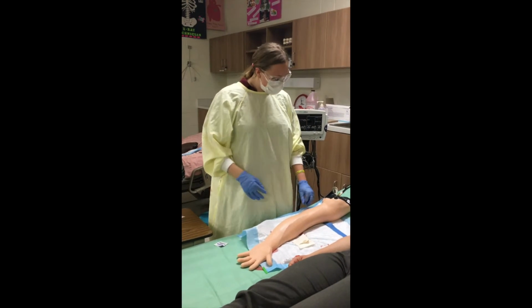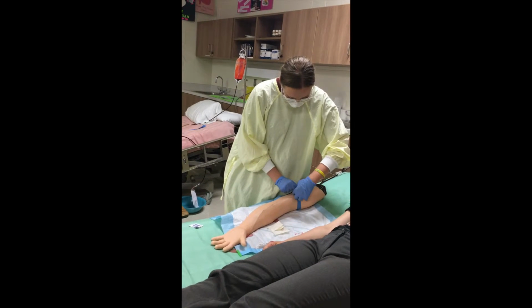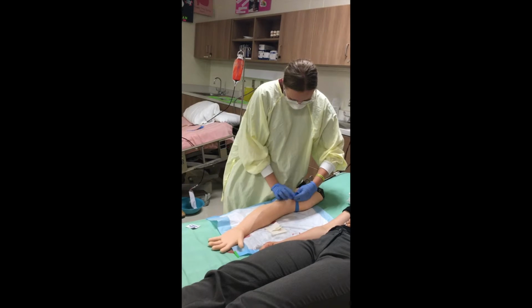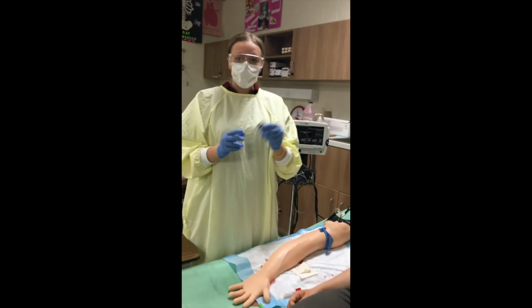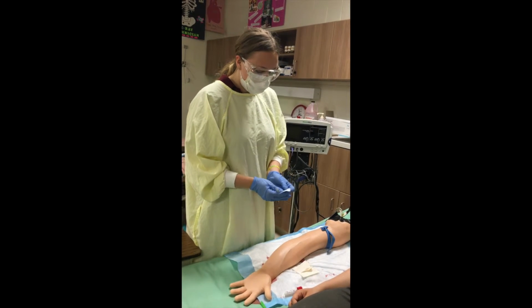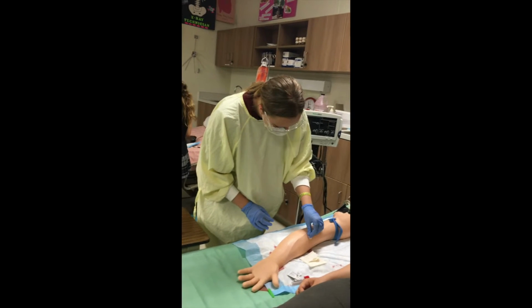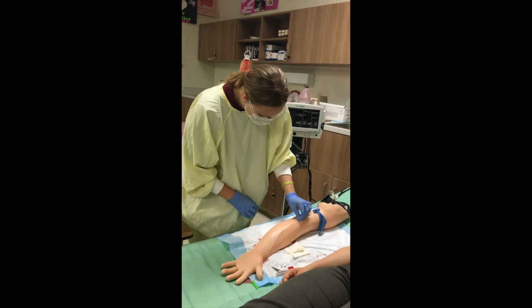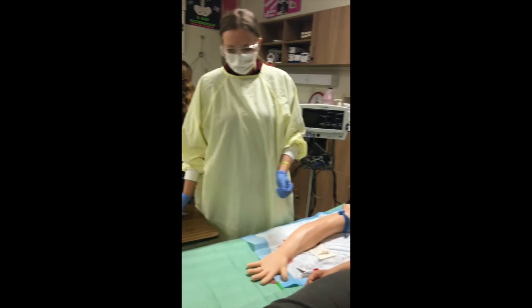Okay, so I'm gonna put the tourniquet on the patient's arm. And making sure that it's able to come off easily, you just loop the one side. I then have my alcohol swab, and I'm gonna start in the middle and make circular motions towards the outside, cleaning the area. And I can throw it out to the garbage beside me.